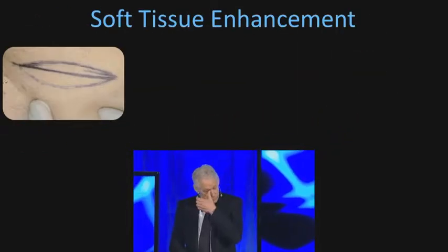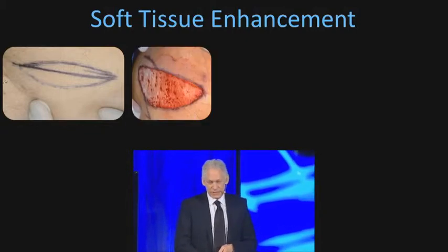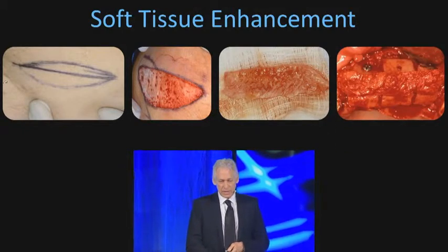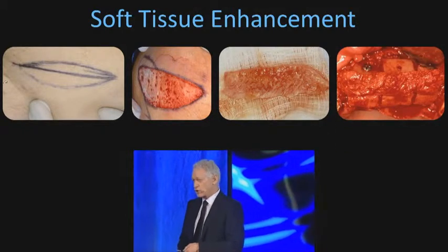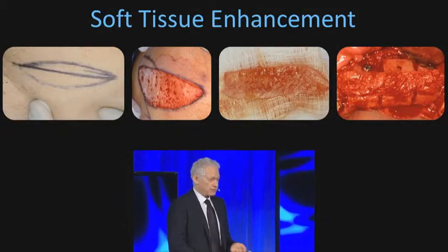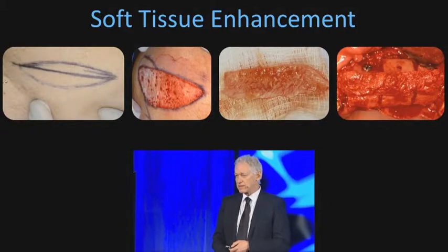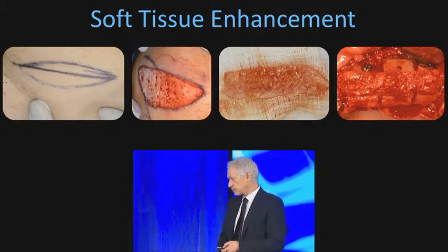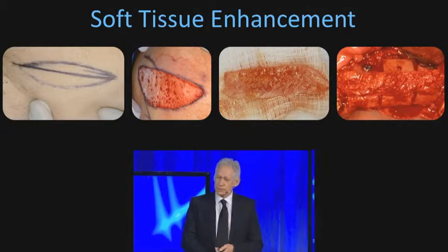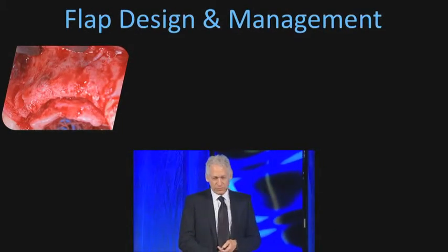Now, if you go into an extraoral site, like an iliac crest, of course, you can take the dermis, do it as a 1 step, harvest it, and then we stretch it and stabilize it over the highest convexity, the area that will move most. If you go intraorally or you're going to stage the procedure, you can first enhance the tissue, make it thicker, and then when you build the tissue, build the bone, that's when you're going to move the flap and split it, like that. So in this case, we went for a staged approach.